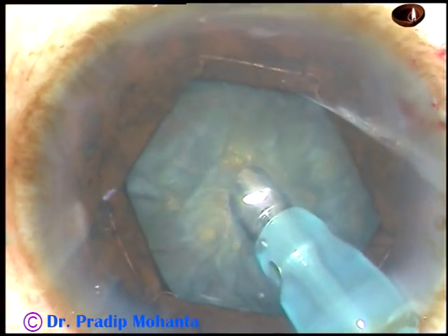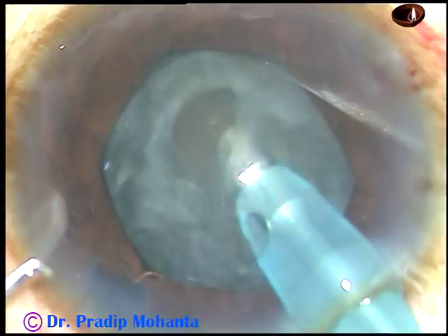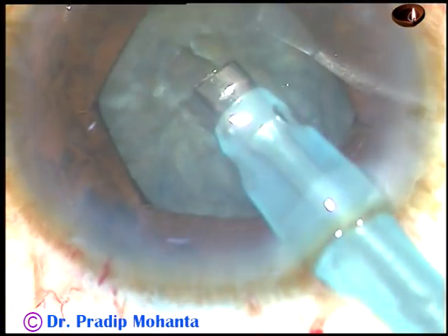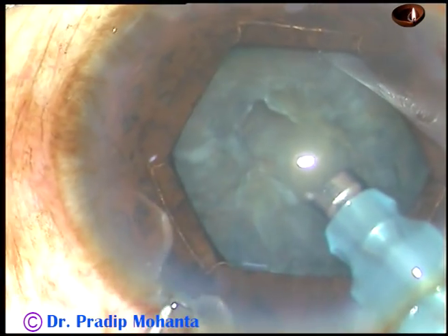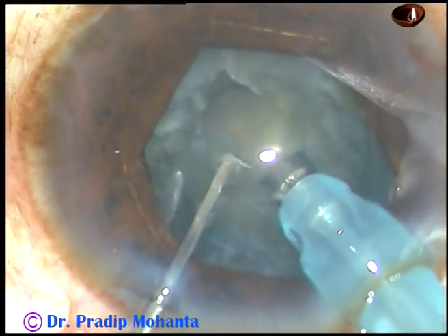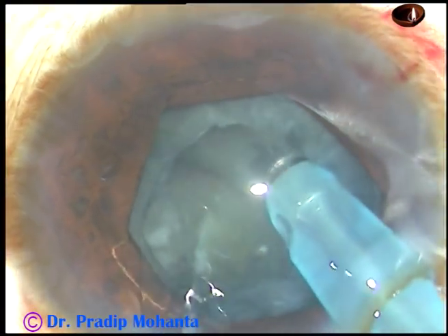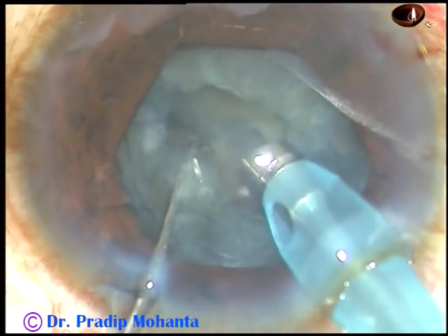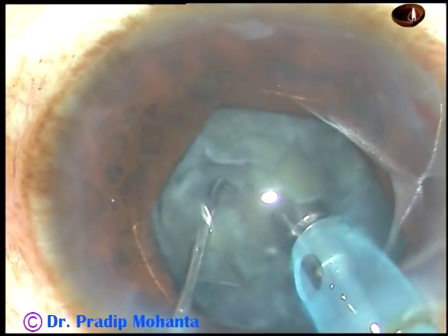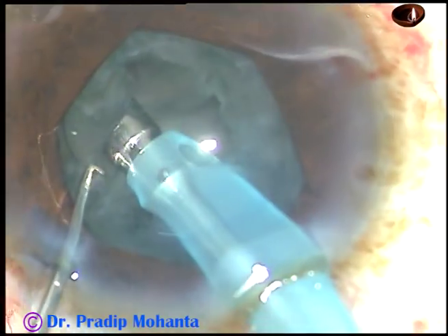Though the nucleus didn't rotate nicely, I proceeded with phaco. Here, what I am doing is trying to chop the nucleus into two parts, though the nucleus is soft. I have buried the tip at the center of the nucleus and I am chopping it. I have been able to divide the nucleus into two parts.